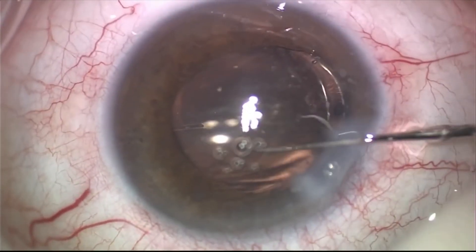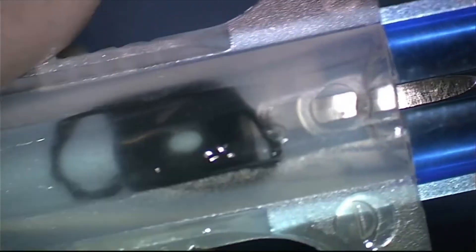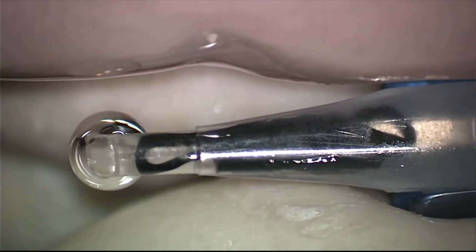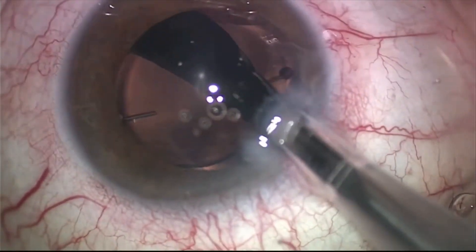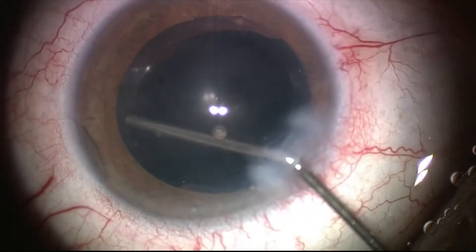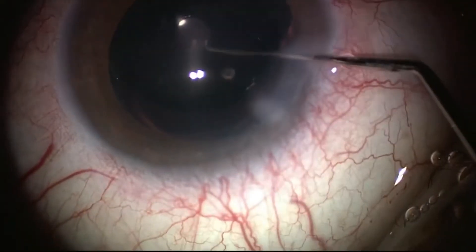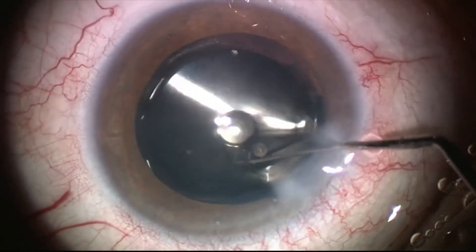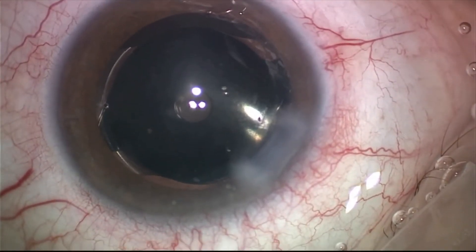We are implanting the lens inside the capsular bag — it is made of hydrophilic acrylic — and it has been dialed to the proper position. Here's the moment of truth: we're using the Extra Focus pinhole implant made by Morcher, using the D cartridge of the Monarch injector. This is a pinhole implant with no refractive power, only a 1.3 mm aperture within a 6 mm occlusive portion. We noticed one haptic was in the sulcus and the other in the bag, so we inflated the bag to place everything inside the capsular bag together with the IOL, which was achieved with relative ease.